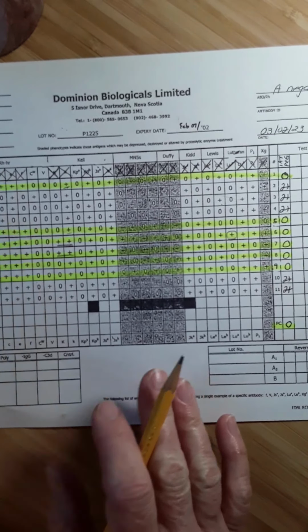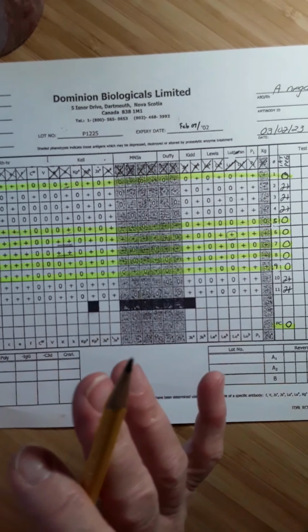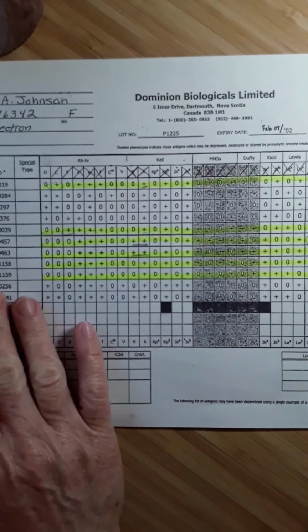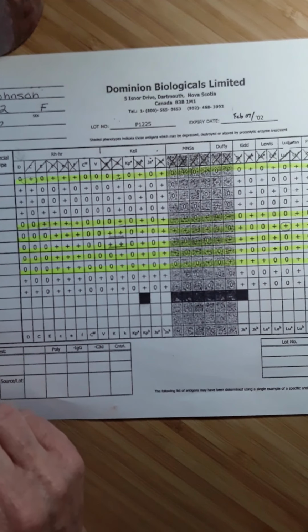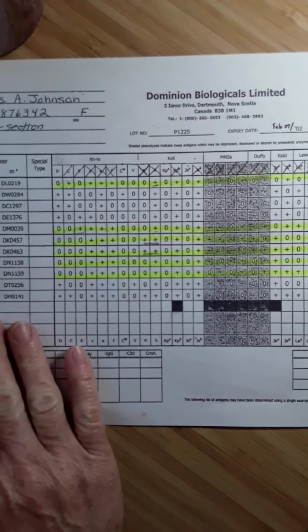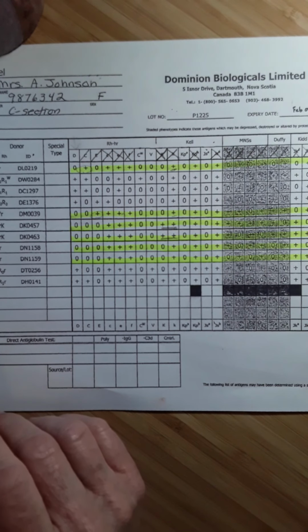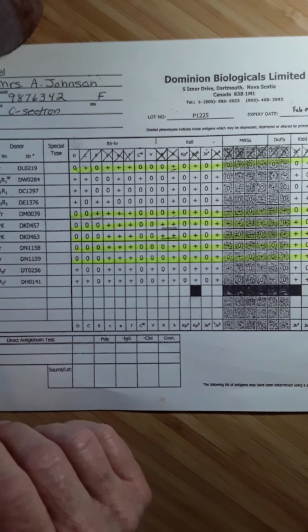I'll stop there and say, if this is not what you got as far as crossing out, then I'd like you to send me an email and let me know what's different, because there's really no point in continuing unless we've got this part right. What I do now is take a look at what I've done and do what I call marking up. This is just a way for me to denote things that I'm really not going to worry about further, and then think about things that I am going to be concerned about.